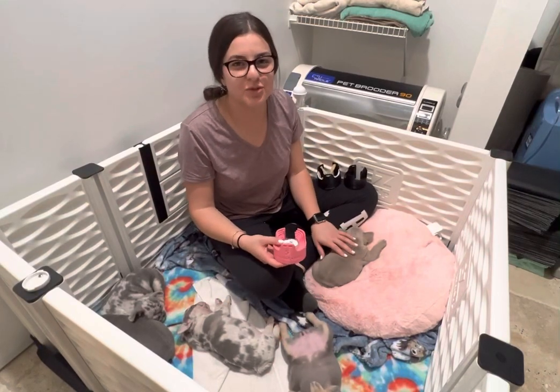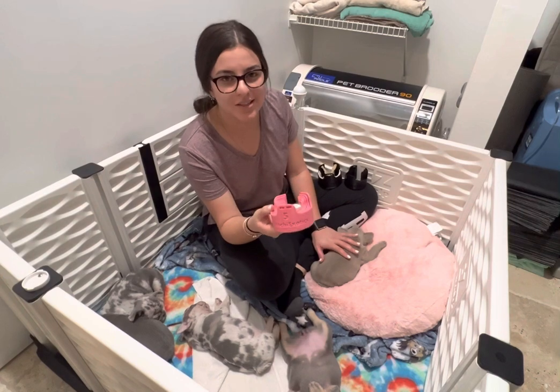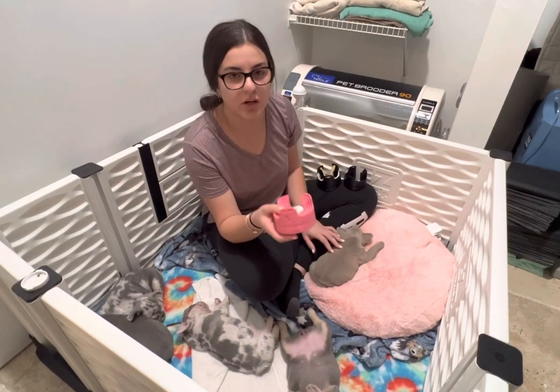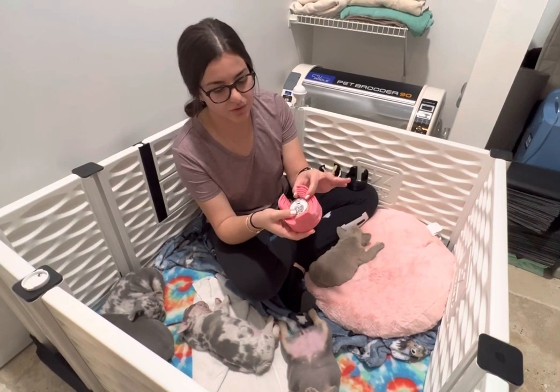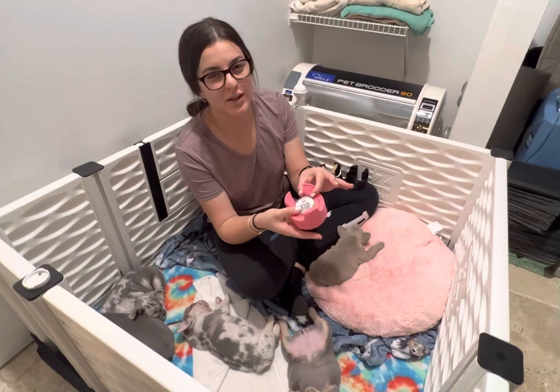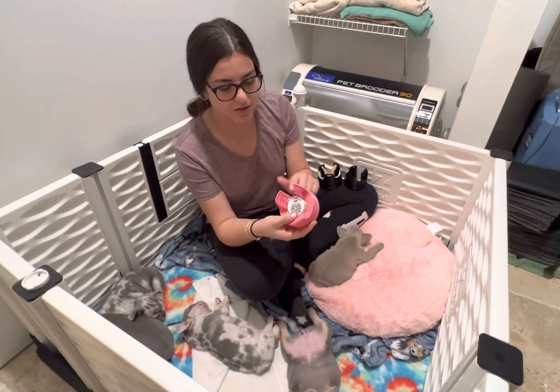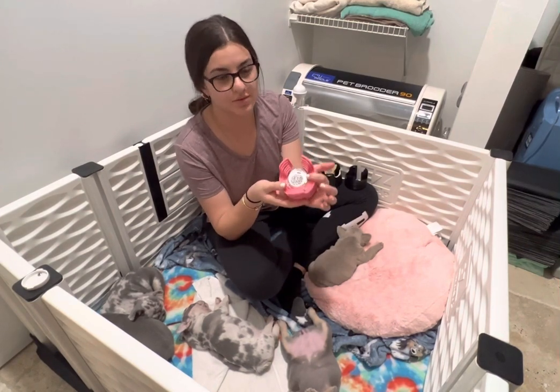Hey guys, this is Sabrina from Frenchiexotics. I wanted to share with you guys some improvements we've made to our flat chest kit. We've been working with our reproductive vet and breeders from across the country to improve it. Our new kit comes with six different sizes and it can be used to treat flat chest in newborn to five week old puppies. It also comes with self-adhesive tape and a QR code that links back to this video.